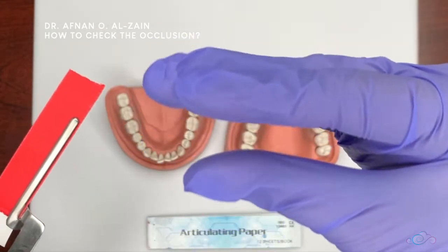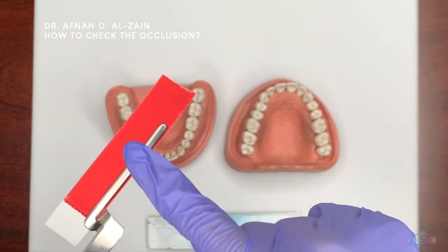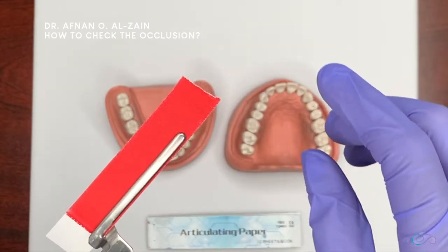The purpose of the articulating paper is to check the patient's bite after restoring it, in both centric and eccentric movements — when they bite and when they grind or chew. That is why we have two colors: one for centric and the other for eccentric, and it doesn't matter which color you use for which.